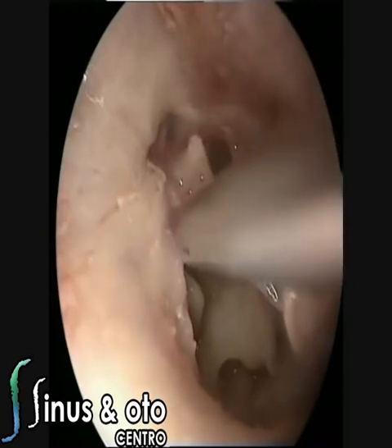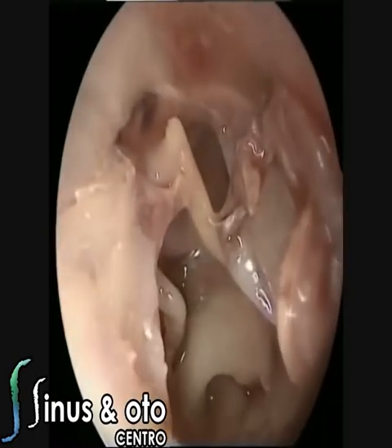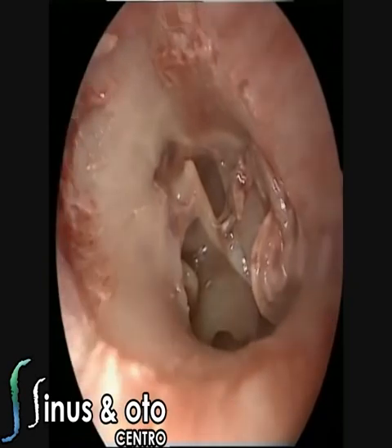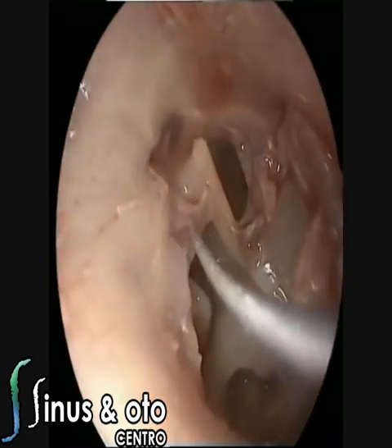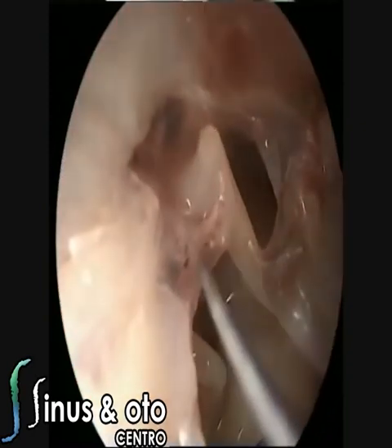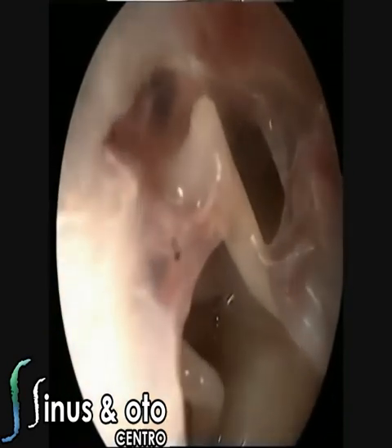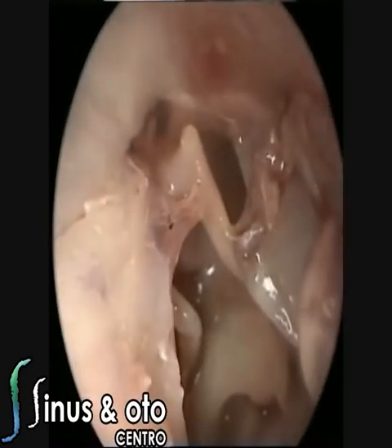So of course this is the posterior malleolar ligament. Behind you can see the chorda tympani nerve, and in this specimen we can see the ventilation routes. Most of the inflammatory diseases of the middle ear start at the middle ear. They don't start at the mastoid. They happen to be at the mastoid in some cases, but they start at the middle ear because of blockages of the ventilation pathways. We have three main ventilation routes at the middle ear.